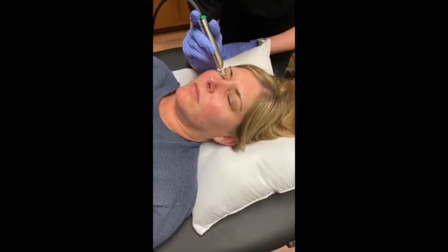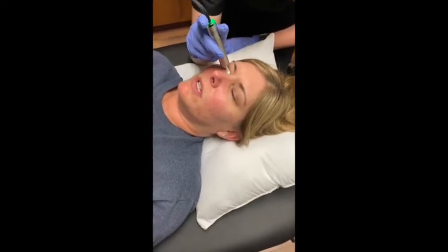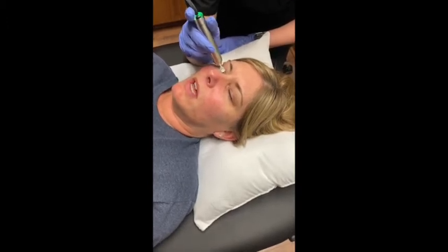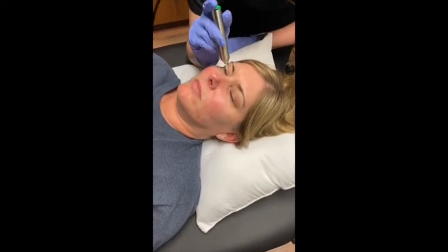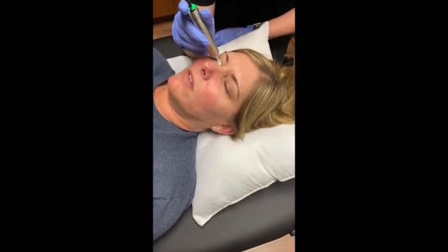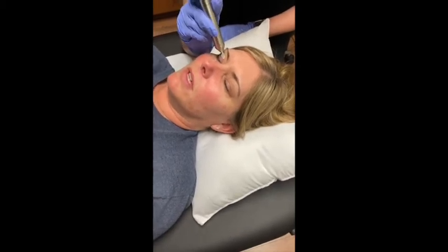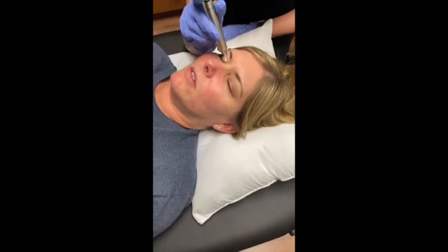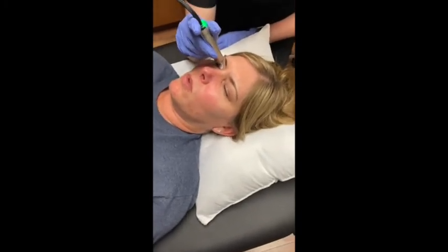Okay. Does it ever hurt whenever we're doing this? No. Never really stings or anything like that? No. Just after the procedure, my eyes are a little tender because of the pressure, but it's not uncomfortable. Okay. Now, does it feel really good when she goes in any specific area, or does it feel about the same everywhere? It feels really good when you do the upper part of my eyelid. So when she goes up there, yes. That's where more of the irritation and the rough skin and the redness is, and it's a little bit swollen.